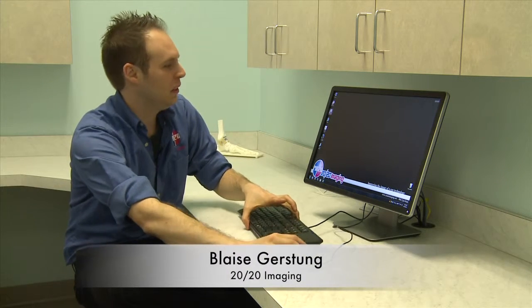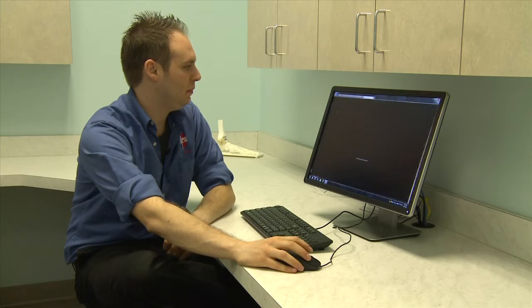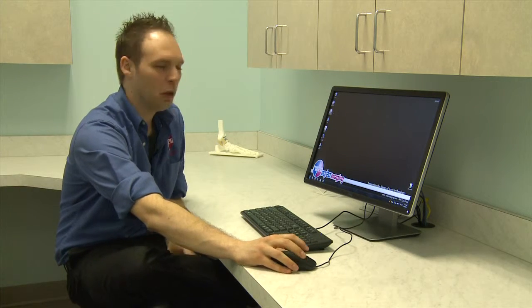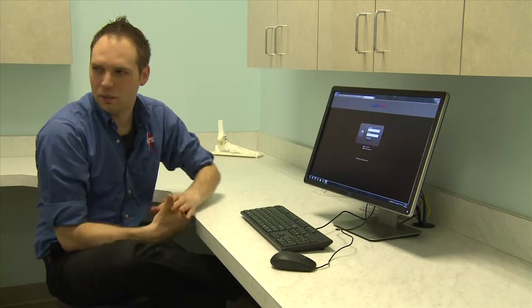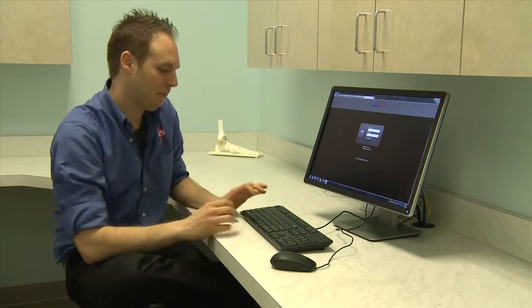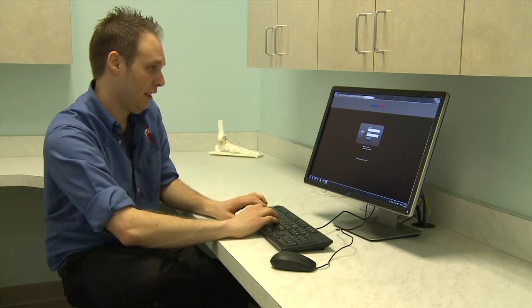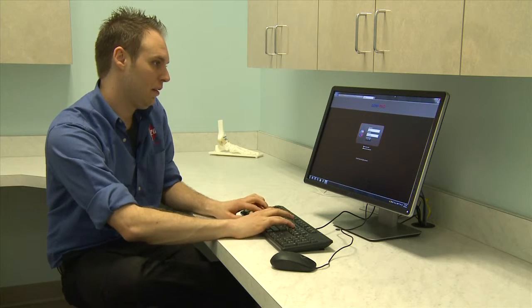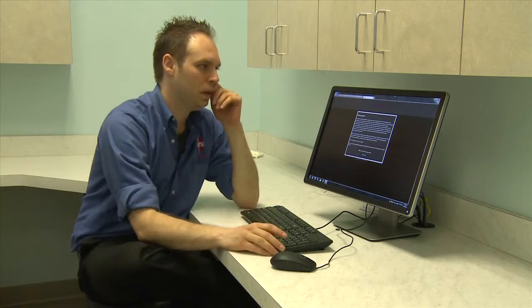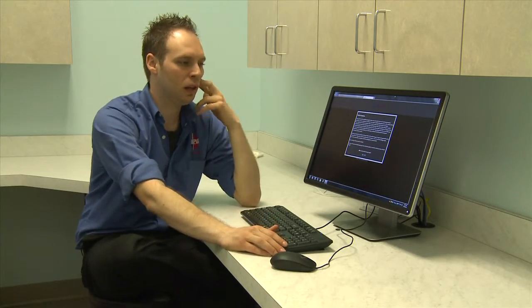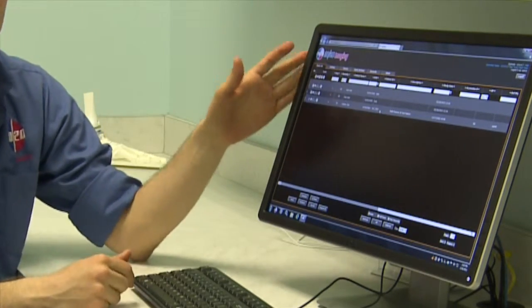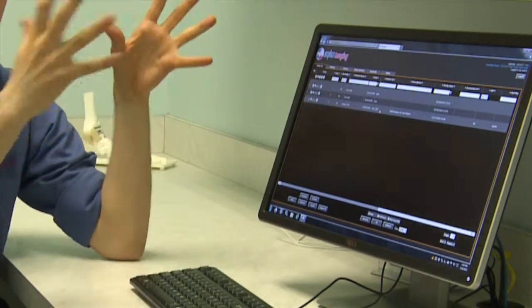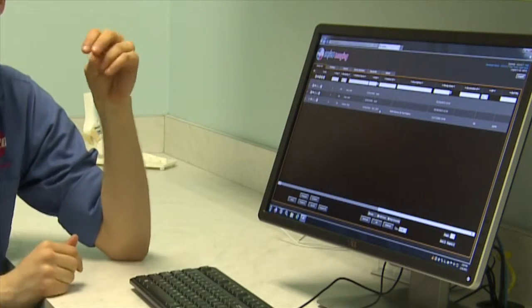Now we're going to go through the training at the server. You'll see a shortcut on the desktop called Opal Web. Open that up — the login is the same: admin and 2020 Tech. You'll hit a compliance message once you log in, and now we're back at the study list in the web-based version. The software version is only in the acquisition room.